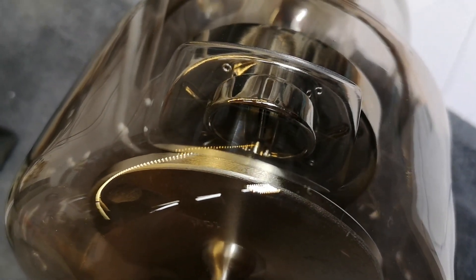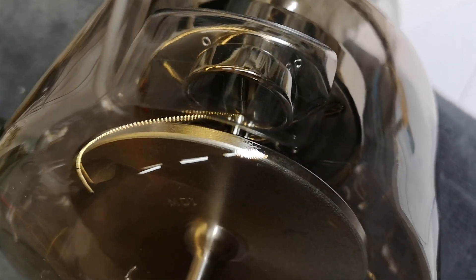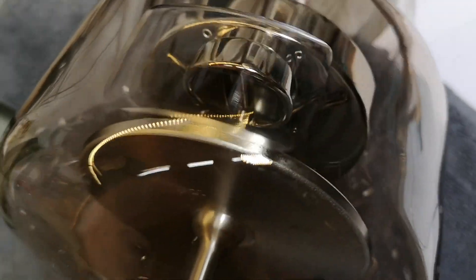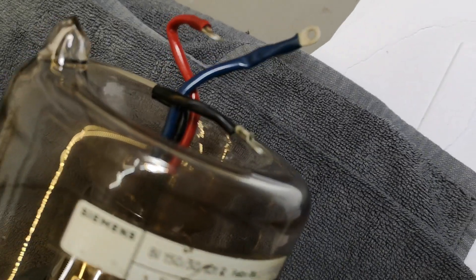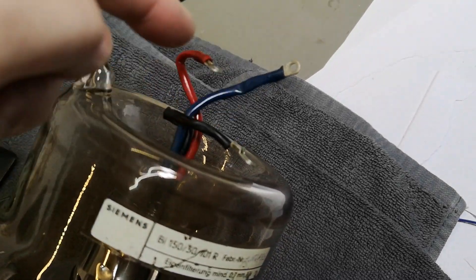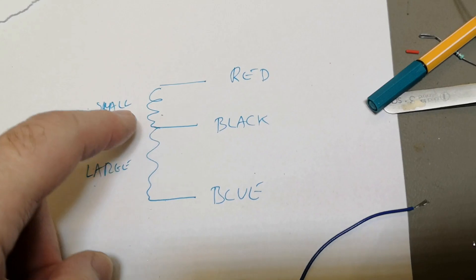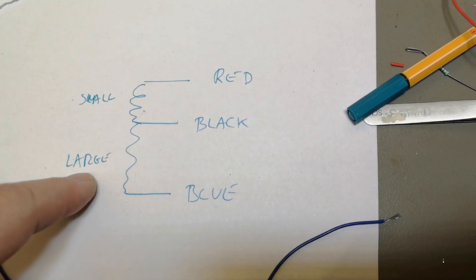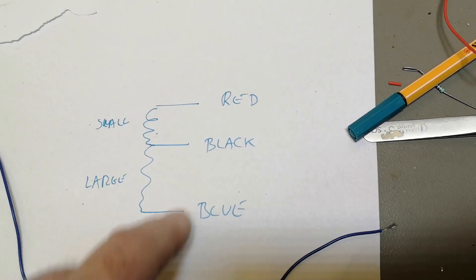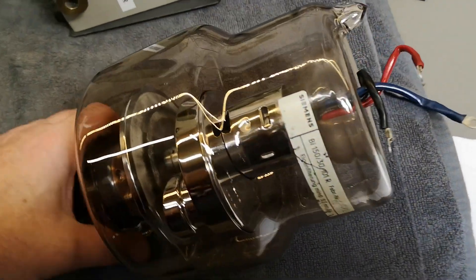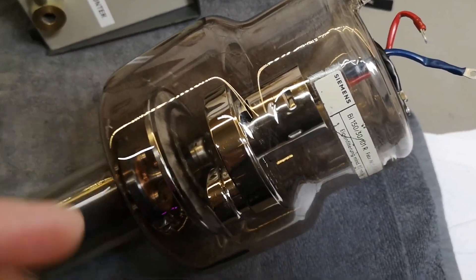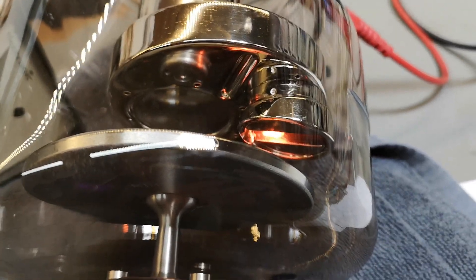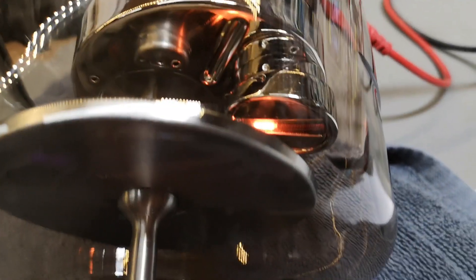This one is a double cathode or double filament. It's easy to see on the number of wires here because we've got three wires. I figured this out - we've got a small and a large filament coil. So look, this is the red and the black wire, that will be the smallest filament.